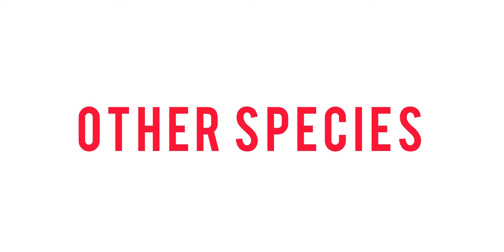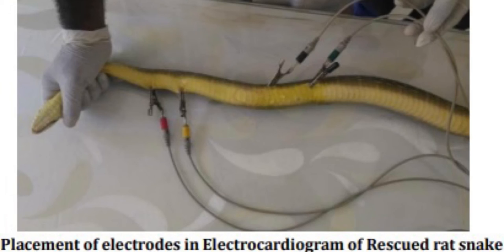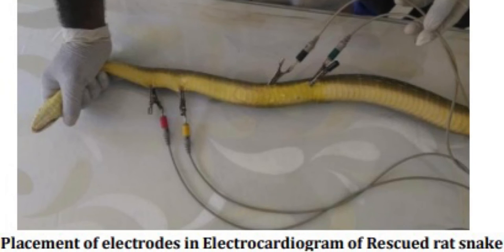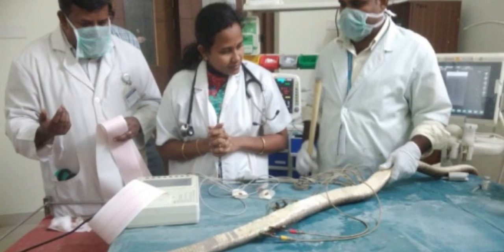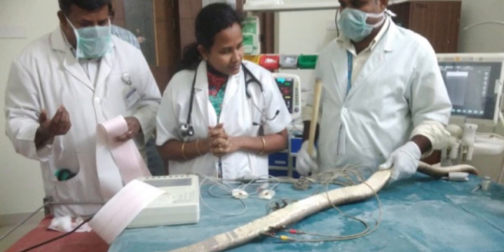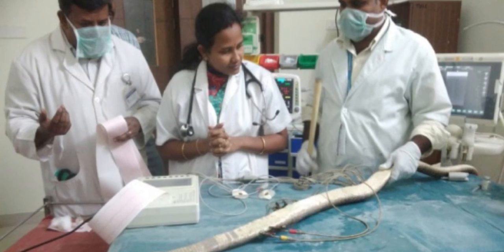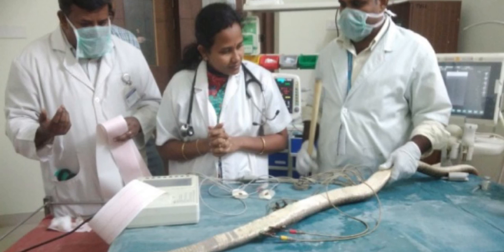In snakes, the heart is found along the midline axis and its longitudinal position varies with species. In marine and freshwater snakes it is positioned near the middle of the body, whereas in non-arboreal snakes the heart is at about 25 percent of total body length, and about 15 percent in arboreal species. Electrode placement varies by species but is inspired from the traditional four-limb lead placement, with leads placed two heart-lengths cranial and caudal to the heart.